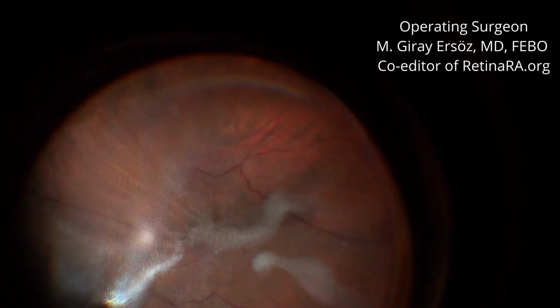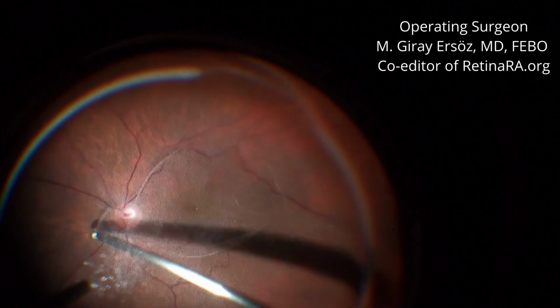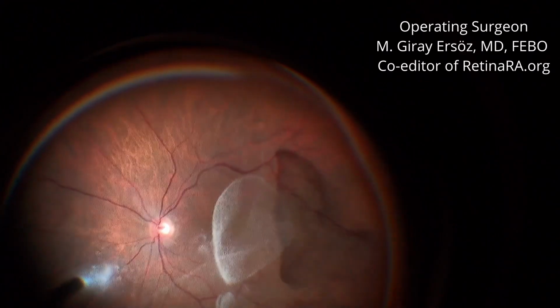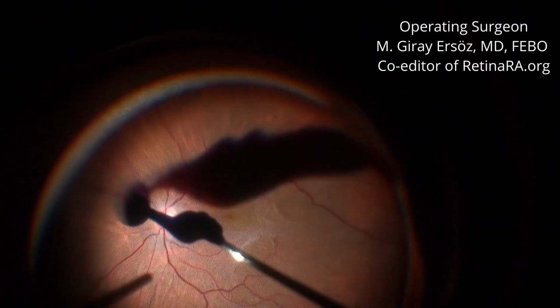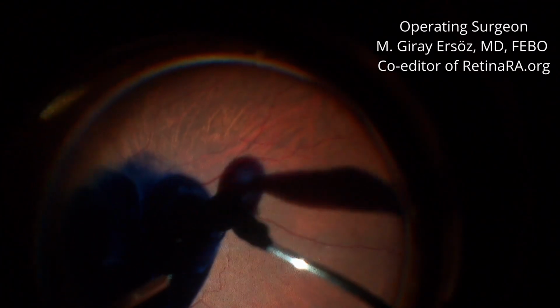Surgical planning was based on the preoperative OCT findings. The posterior hyaloid should be separated carefully from the optic disc and temporal retina, where pre-existing retinal damage is present. As shown, I was able to elevate it smoothly without inducing significant damage. I prefer using dual dye for staining, which I typically apply for 45 seconds.